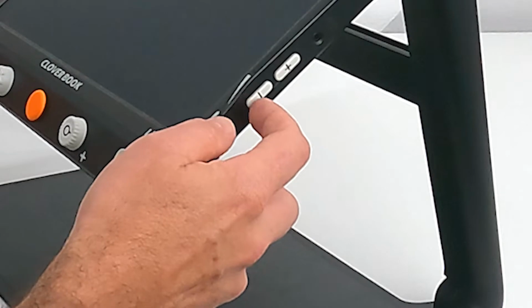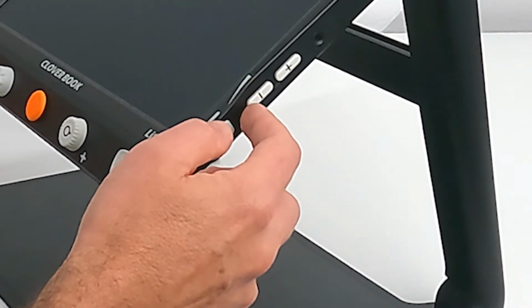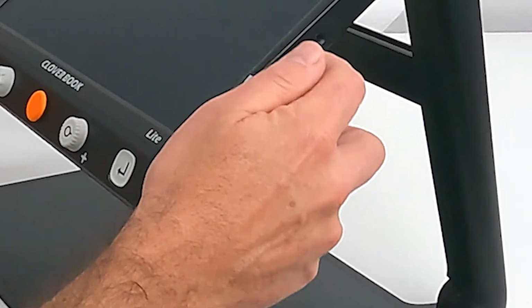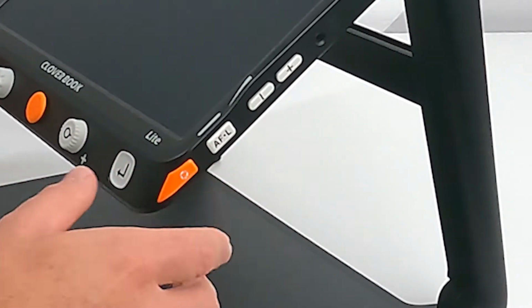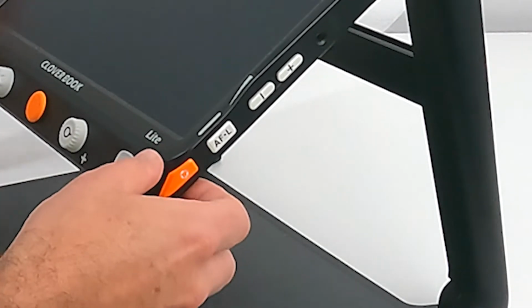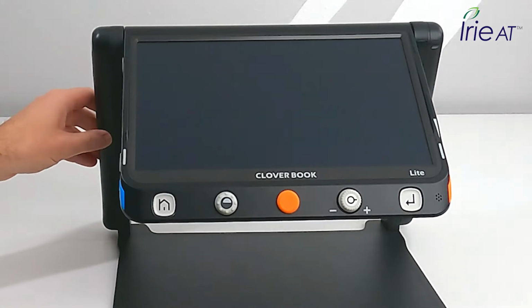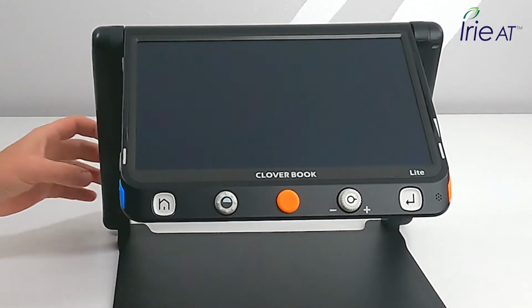And you've got a couple of oval buttons above that. The closest one to the autofocus button is your down volume. Then you have your up volume. And then just above that, you have an indentation you'll feel. That's the headphone jack. This doesn't have OCR speaking on it, but the menus do speak, and there are audible functions to it, so you might want a headphone jack for privacy. So it's a quick overview of the physical features of the device. Why don't we turn it on and take a look at how it works.